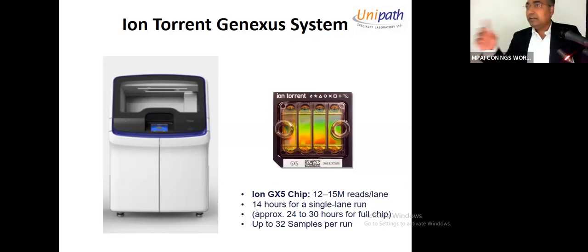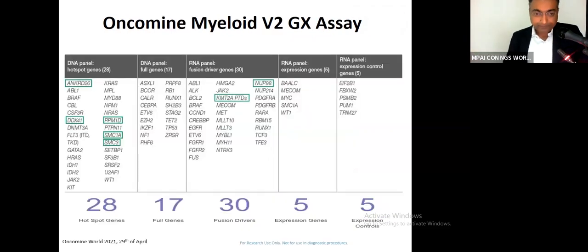And it gives the results in 24 hours, depending upon the assay, between 18 to 24 hours from loading of a sample until the results can be interpreted. Of course, you need to have that many samples to be able to load; like I mentioned, 8 samples to be able to use that.